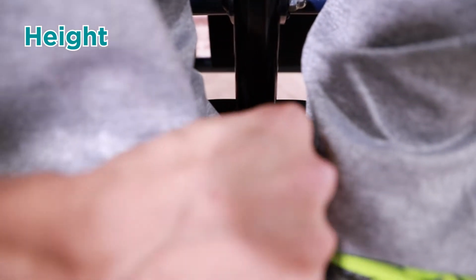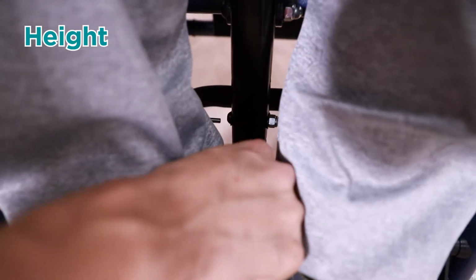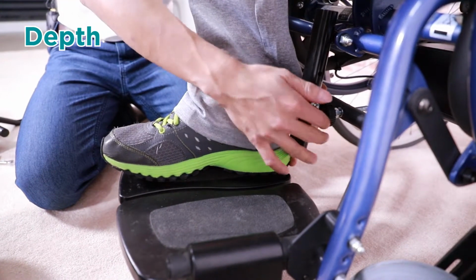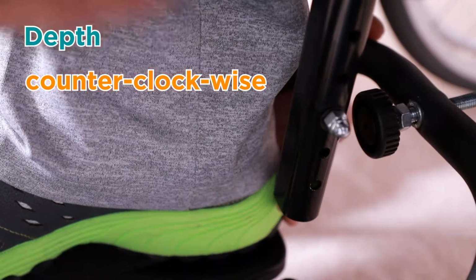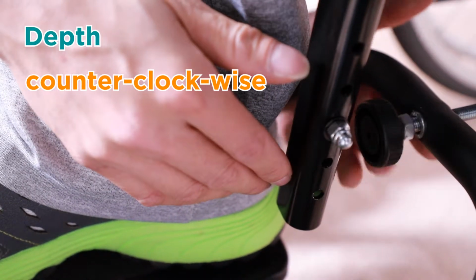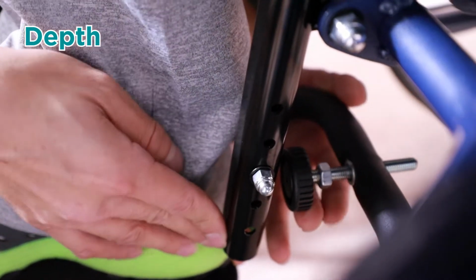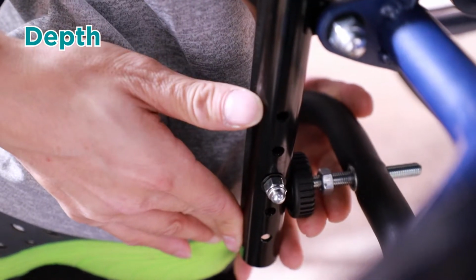Use a simple tool to unscrew them and adjust to where you like the pads to be. When adjusting the depth of the knee support, we need to leverage this knob. Now if I want the knee pad to be placed closer to the user's knee, I will screw the bolt counterclockwise, and press this base until it touches the knob.